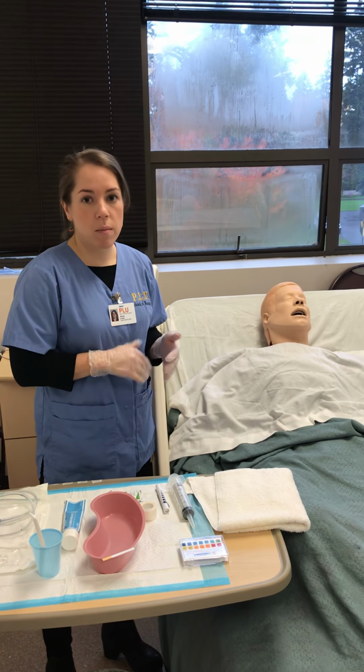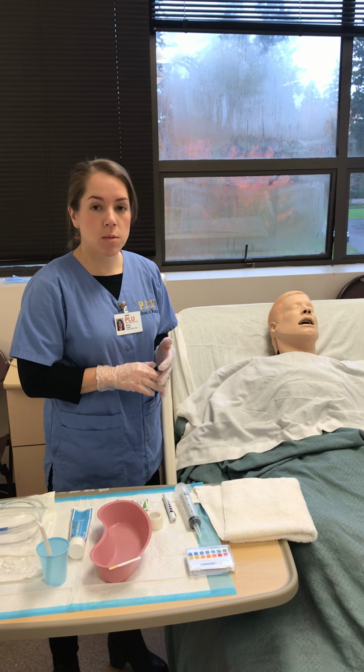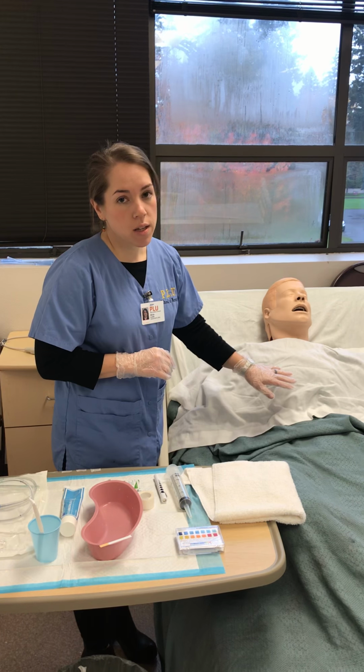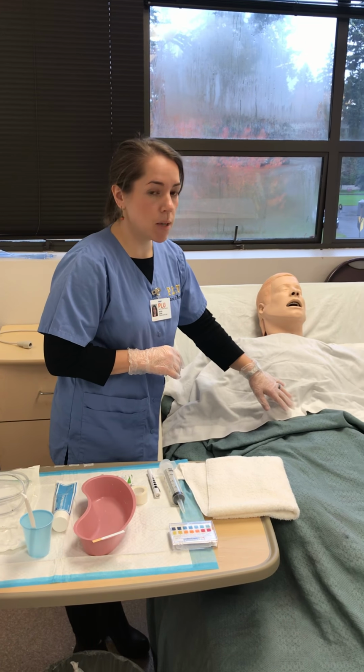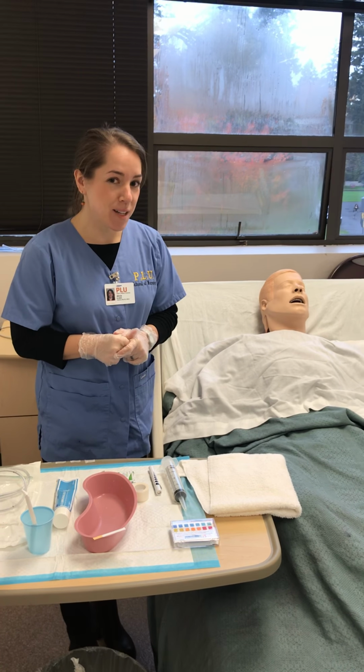So I've asked them about nausea, vomiting, when their last bowel movement was, when they last passed gas, if they're hungry. I've also auscultated their bowel tones and palpated their abdomen. And so we're ready to begin the procedure.